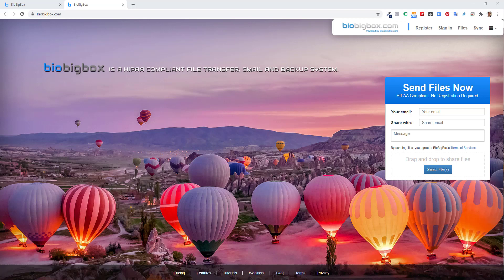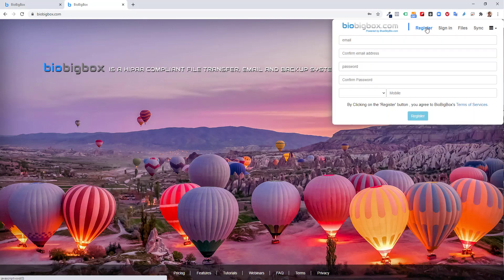This is Michael Saltzman from BlueSkyBio. In this video, I'm going to demonstrate a very easy and organized way to share case files for a particular case between a dentist and a lab, or between two dentists, and I'm going to demonstrate the process via biobigbox.com. Biobigbox is BlueSkyBio's HIPAA-compliant file transfer, email, and backup system. If you don't yet have a biobigbox account, registration is super simple and free. You can use most of the features and functionality of biobigbox at no charge.